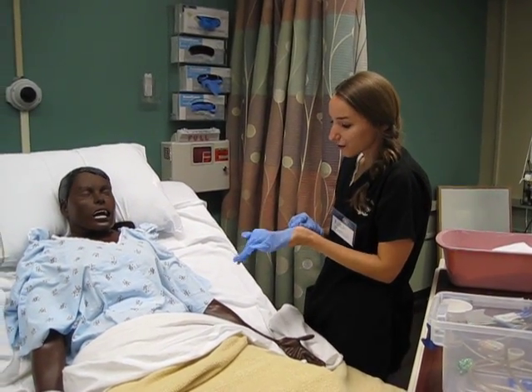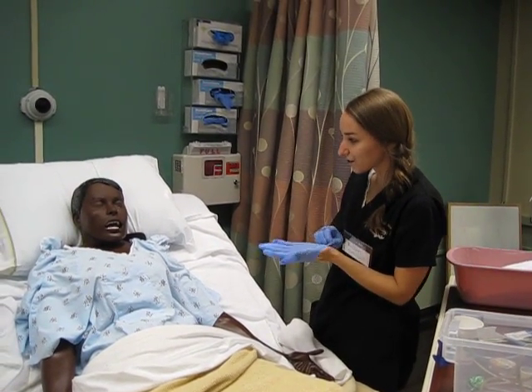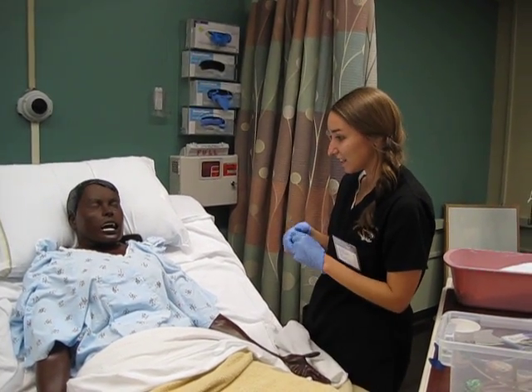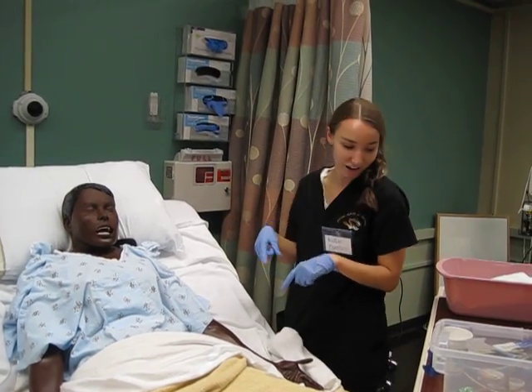First I'm going to have you test your nasal patency. So if you could occlude one nostril — put your finger over a nostril — and breathe in. And do it on the other side. Now, which side was it easier to breathe on? Your left one? So we're going to put the tube down that nostril.